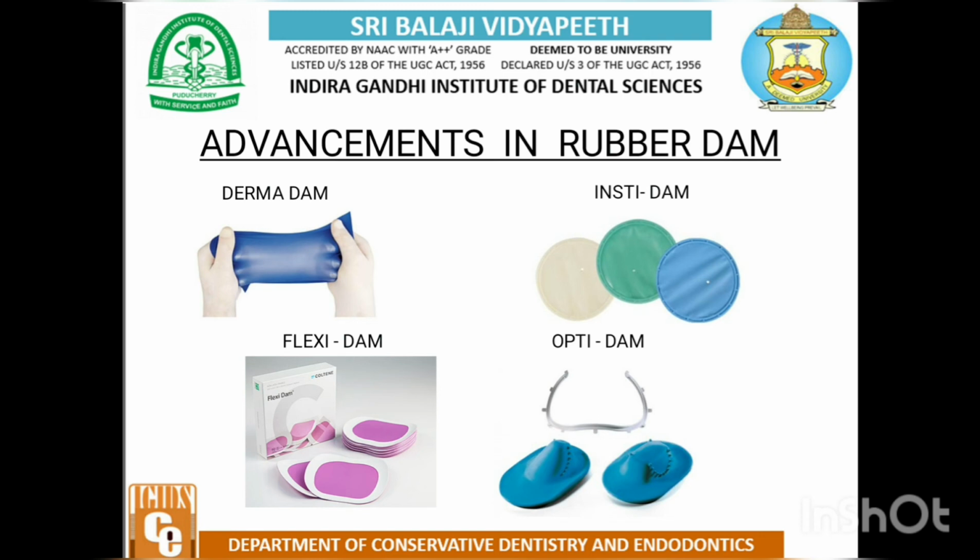It has the following advantages: a built-in flexible frame which eliminates the use of a separate frame, a pre-punched hole, and radiographs may be taken by bending the frame without removing the dam. Minimal pull on the clamp. Single use, and hence eliminates the need for sterilization.